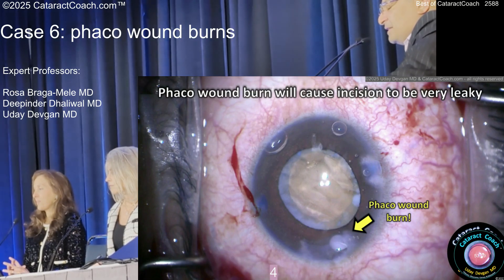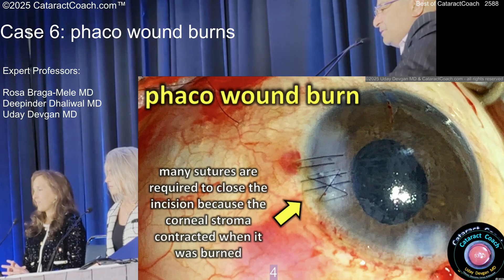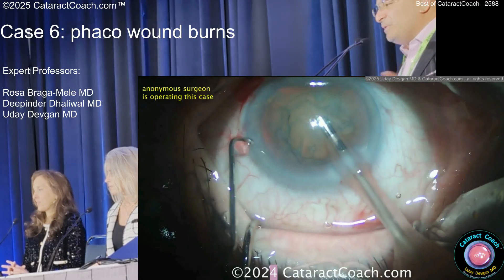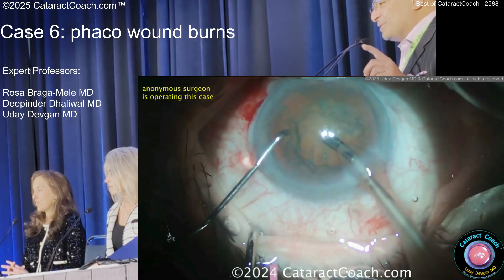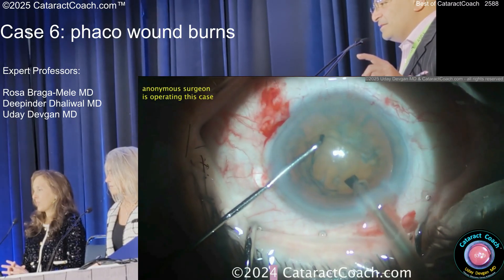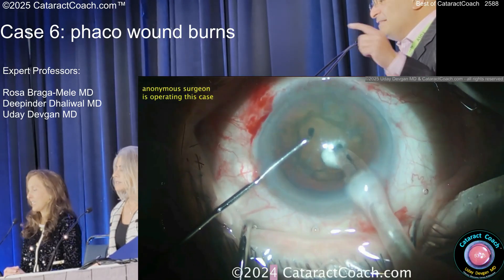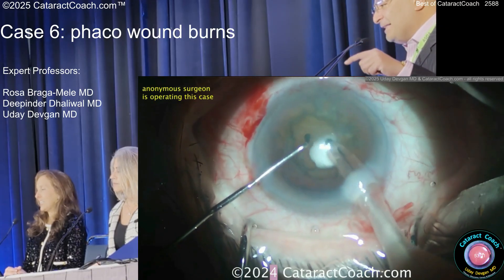So now, how do you close this? Here's the pre-op — a dense white cataract. And then the post-op — just a hot mess. That's the wrong way to suture, by the way. Now watch this: an experienced surgeon operating. You're going to see smoke — smoke sign, smoke sign. Look in the sleeve: there's boiling BSS in the sleeve. You're literally boiling the BSS.